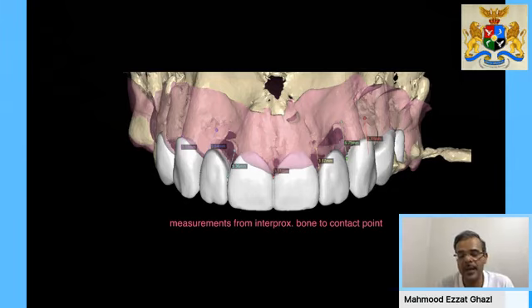We were able to get the aesthetic proposal from the smile design, from the patient's face. From there, the digital wax up, and adjust this digital wax up functionally, then bring in the CBCT and start to visualize the soft tissue deficiencies that we have and where the bone and interseptal bone is. We then referred to the studies on whether we would be able to regenerate this prosthetically or not. Then we decided we're going to go for an FP1 prosthesis.